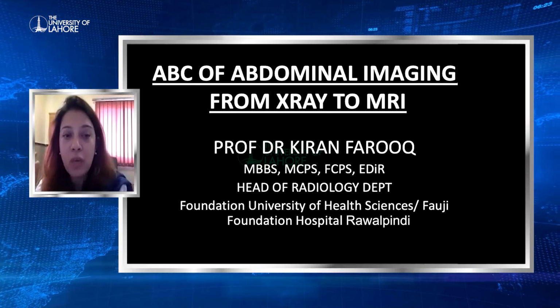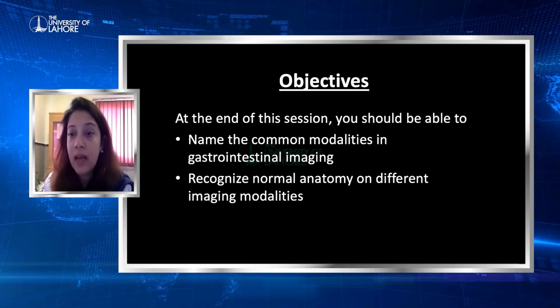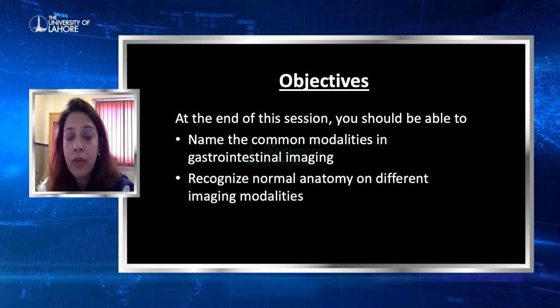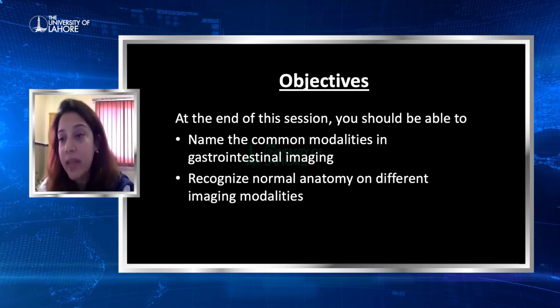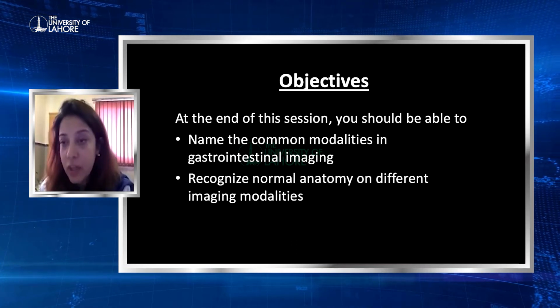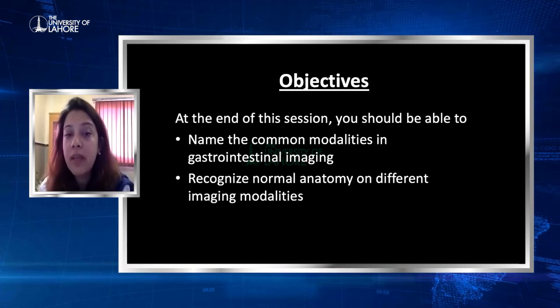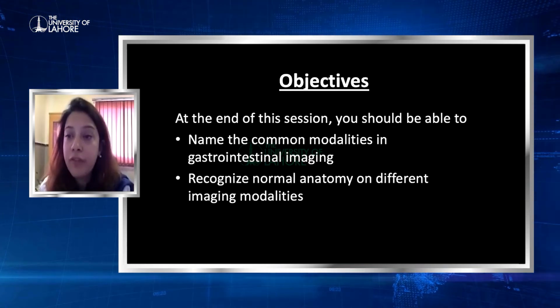Today is to tell you about the ABC of abdominal imaging from X-ray to MRI. So let's start. The objectives of today's talk are that by the end of this session, you should be able to name the common modalities used in gastrointestinal, or GIT, imaging, and you should recognize the normal anatomy on different imaging modalities.